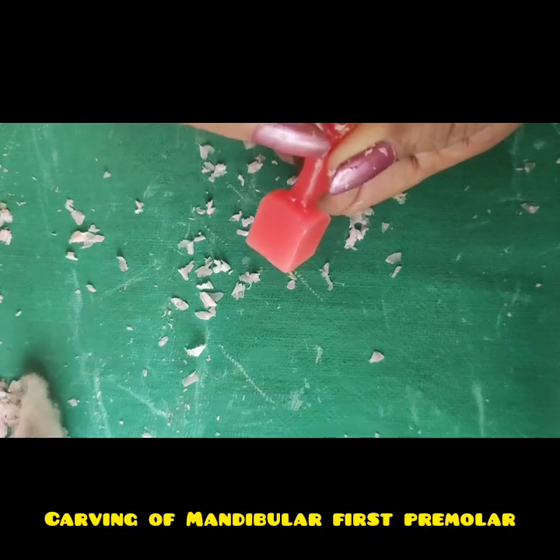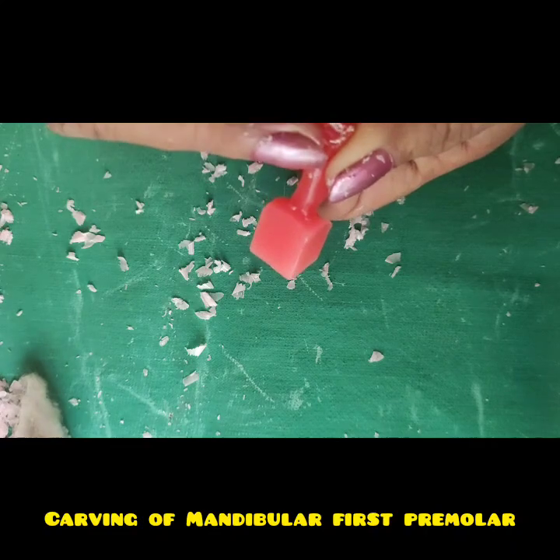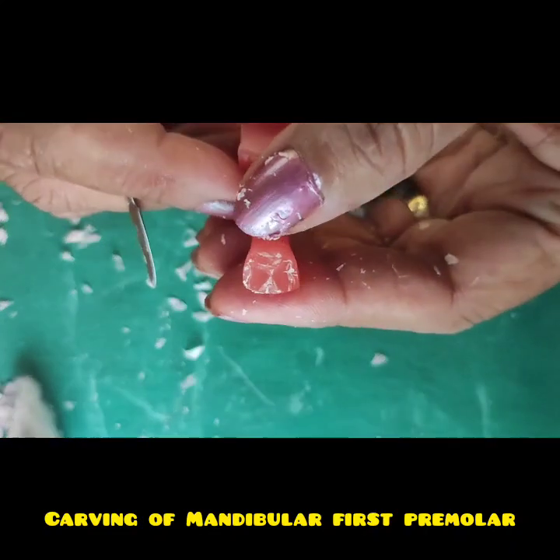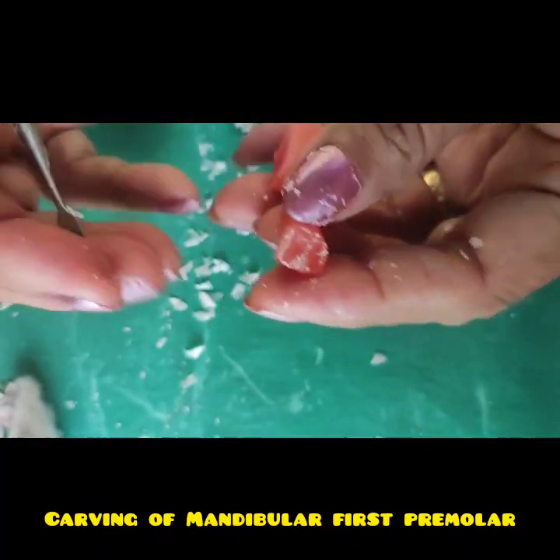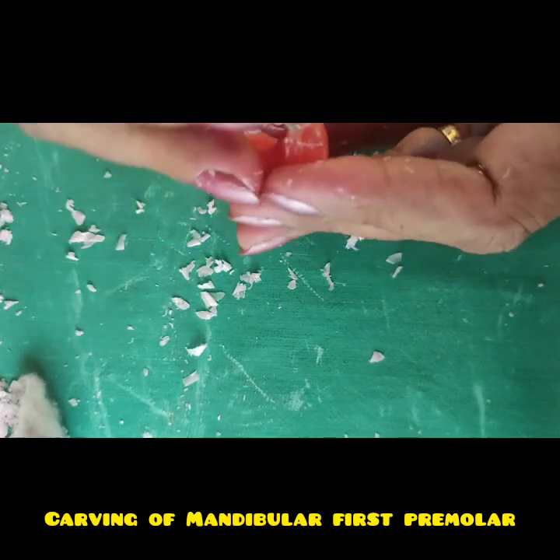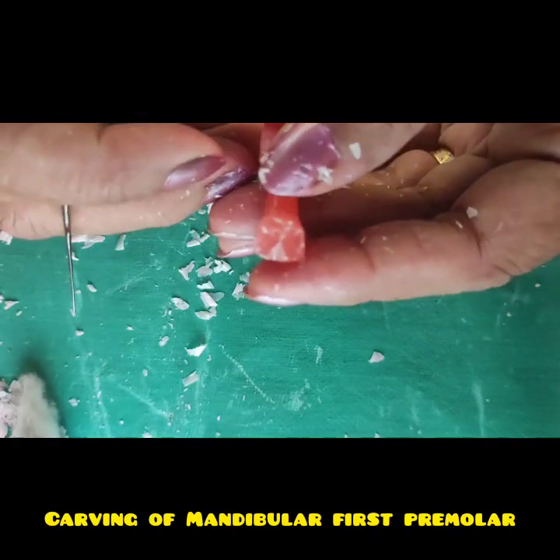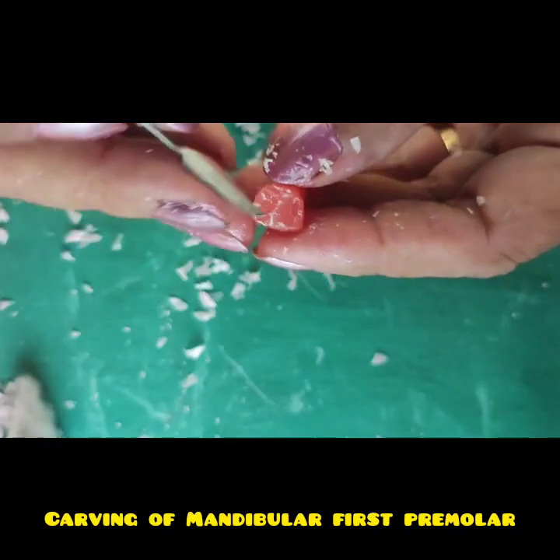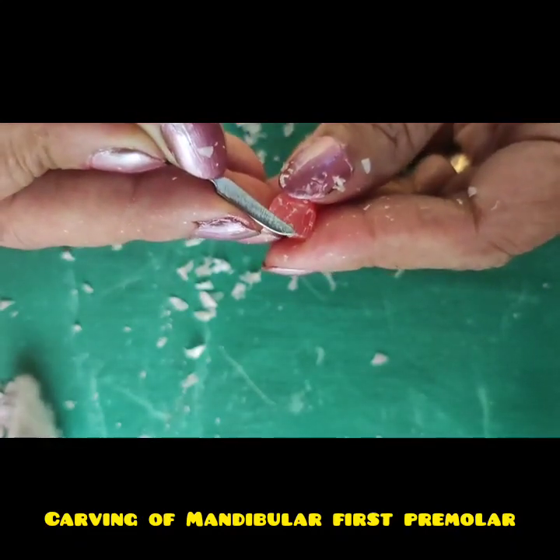Like this, define the grooves and inclined planes. So you can make out a nice cuspal ridge. Remove the step at the marginal ridges which we have got after this. You can make out there should be a nice single cuspal ridge.